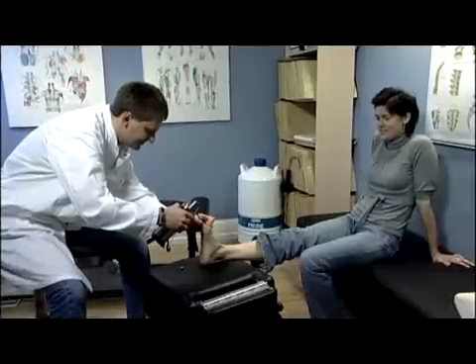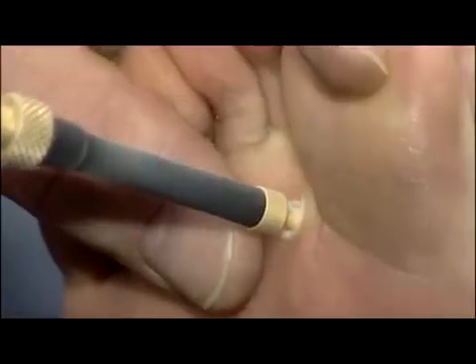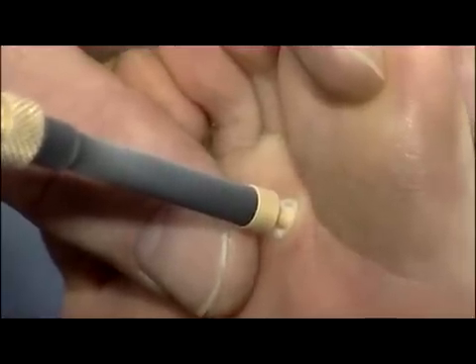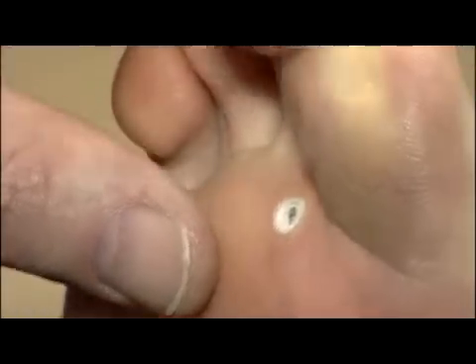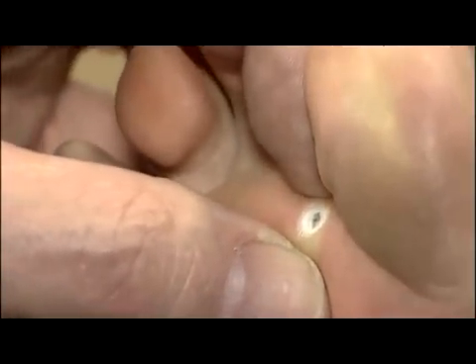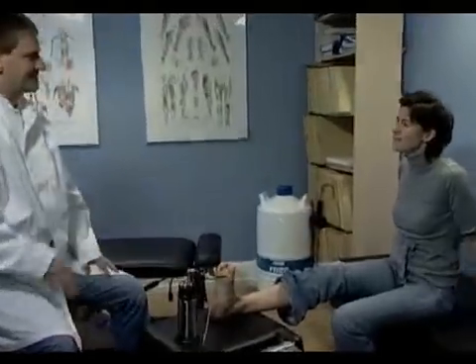This method ensures the quick freeze slow thaw, leading to optimal tissue destruction. Contact freezing offers a deep freeze with minimal lateral spreading. The freezing time depends on the type of lesion as well as the operator's personal preferences.